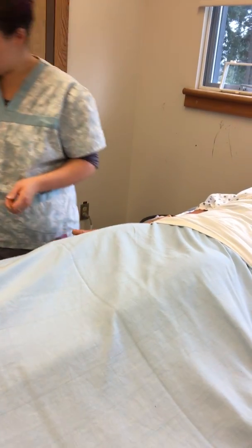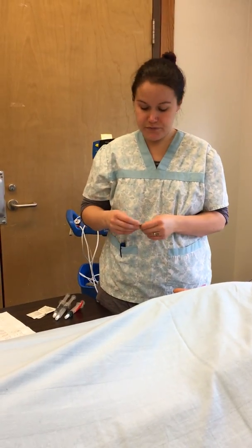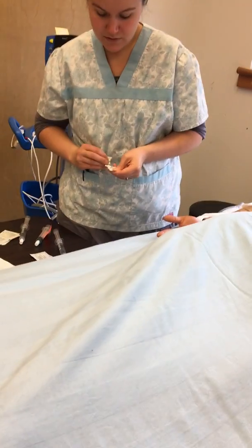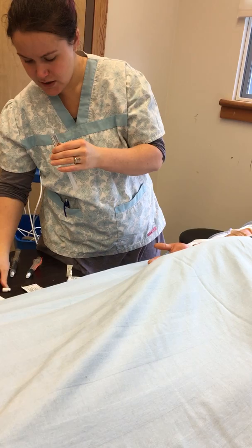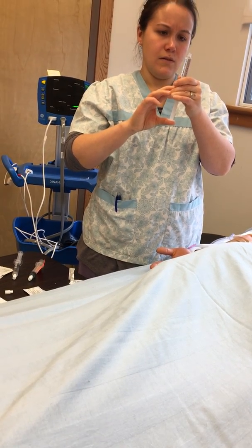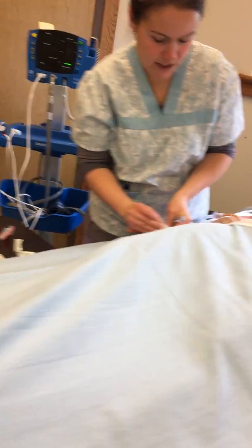Okay, so now that I've checked everything, cleaned my hands, baseline vitals, now it's time to give her her medication. So the first thing I have to do is, I should get the air out of this first. So I'm gonna go like this. Whoops, okay, that's fine. Sterile no touch technique to the top. Grab my alcohol wipe. Clean this for 15 seconds.